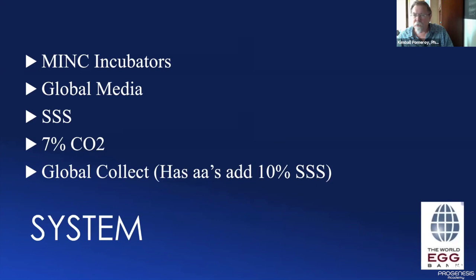Add to that, how does an oocyte control its pH? Brian Lamanto, one of our embryologists, is looking at that for his PhD project, but we don't think that it controls its pH very well, and nor does it control its osmolality very well. So we've developed all these things for embryos, but we've left out the ideal culture system for oocytes. What is that?